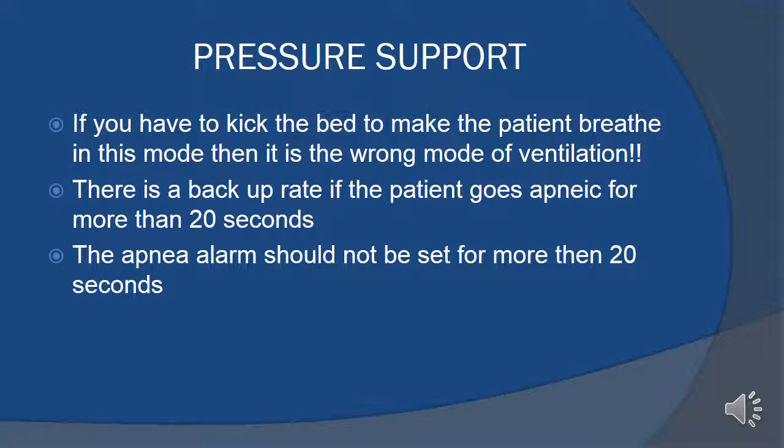If we keep doing this, what's going to happen, all these periods of 20 seconds of apnea, the patient's going to decompensate. And what that really means when a patient decompensates is they're de-recruiting their alveoli. We're going to have to re-recruit these at some point. And it's these re-recruitment maneuvers that often cause shearing damage to the airways that leads to ARDS. That's a bad thing. So if we have to kick the bed or shake the patient, or kick the patient and shake the bed, whatever you want to do, don't be in this mode of ventilation. Wrong answer.